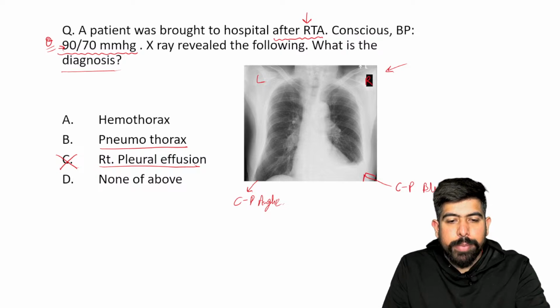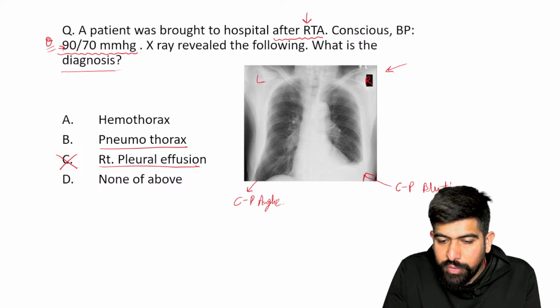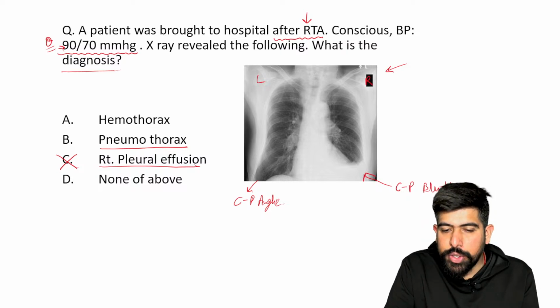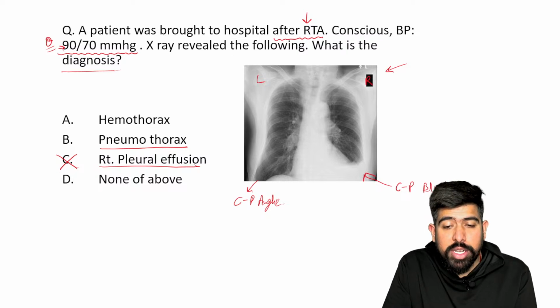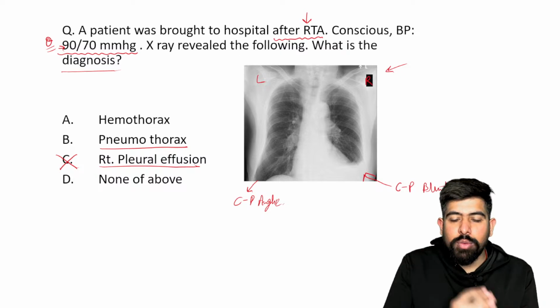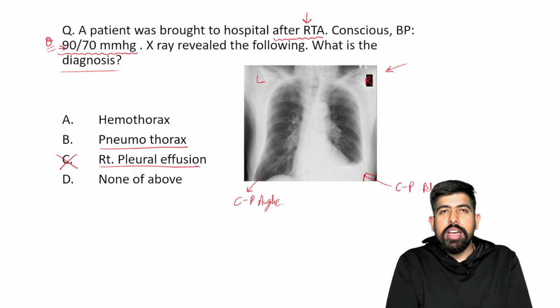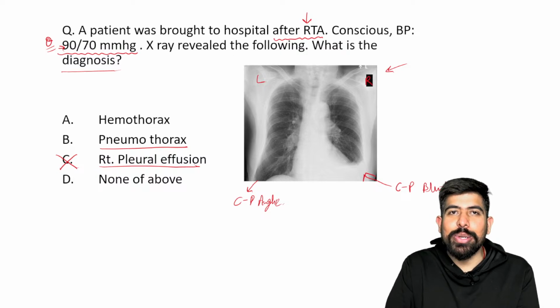Who is replying B? Just let me know about it. That is why I thought of effusion, there is no history of RTA. Yes, if there is no history of RTA and this X-ray is given to you, that should be pleural effusion. That's why I'm clearing up what the examiner wants to confuse you with. You are not reading what is happening in the exam. Please understand this. What you will do on the 12th of January, maybe this is possible, but after this session, I think you will not do this.